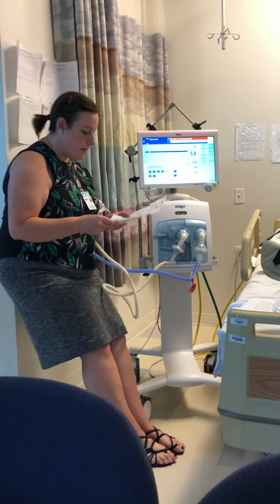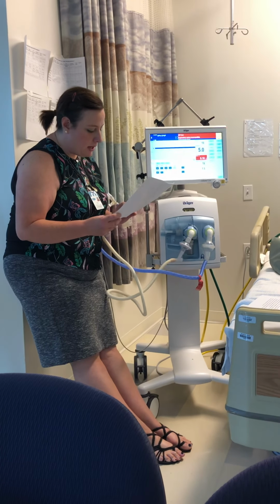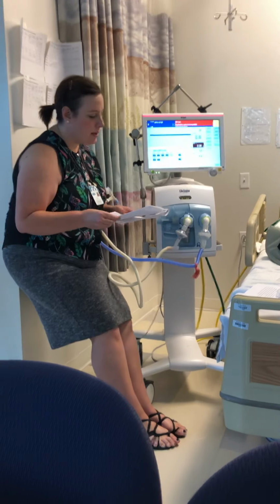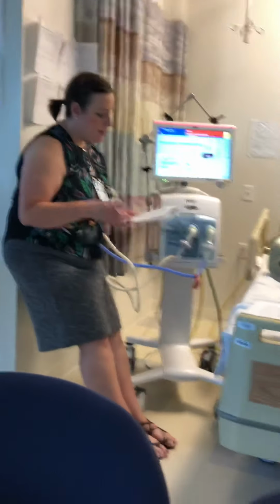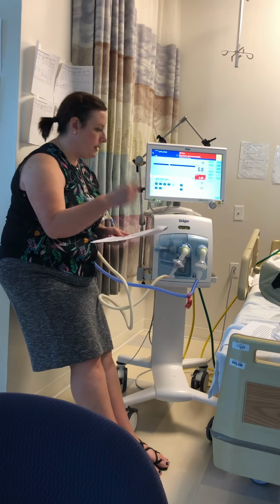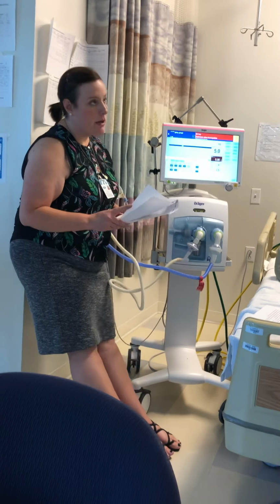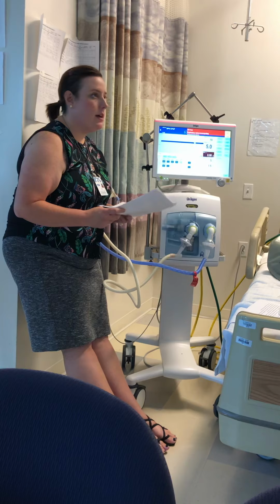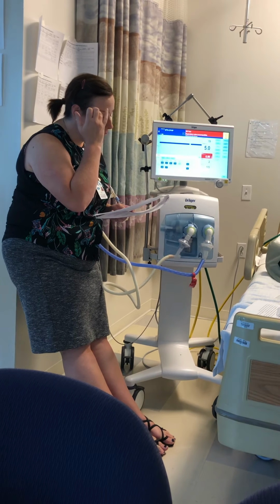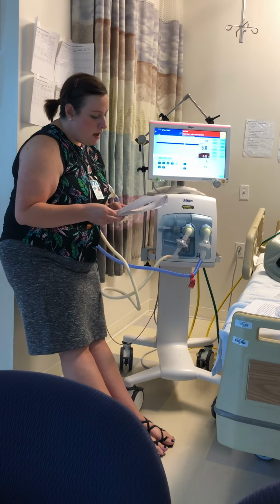So we've introduced ourselves to the family, we're going to tell them what we're going to do, connect the CPAP up to the high pressure, the electrical outlet, assemble the circuit. Like I said, as far as the operational procedure, the whole setup depends on whether I can actually find the Neo flow meter. I'll let you know by next week. If we don't have it, we'll completely omit that step. We'll initiate CPAP. I'll tell you the settings, the CPAP, the FiO2 level.